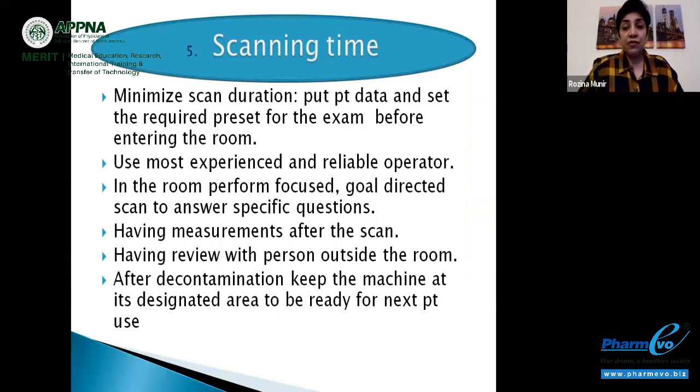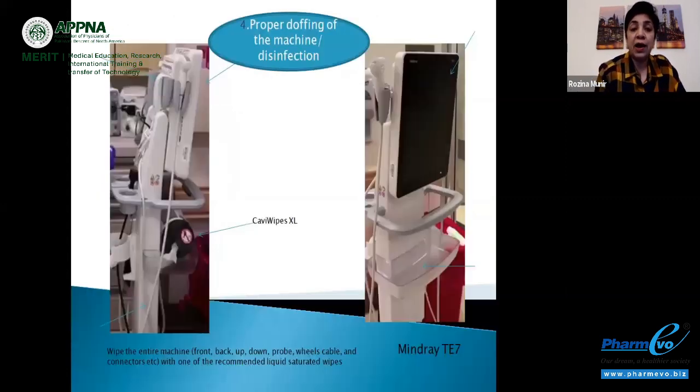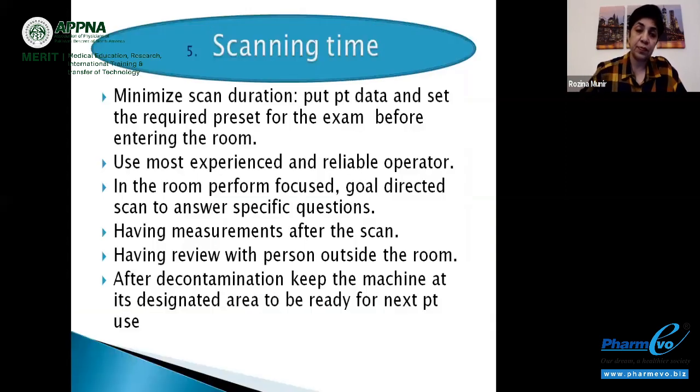So after that, once you are out of the room, you have to clean this whole machine again by changing the gloves, new gloves, and then cleaning the whole machine. This is all you practice after you come out of the patient room. You clean it the second time and then put the machine back to the dedicated area so that everybody knows that this machine is now clean and ready for the next patient to be used.